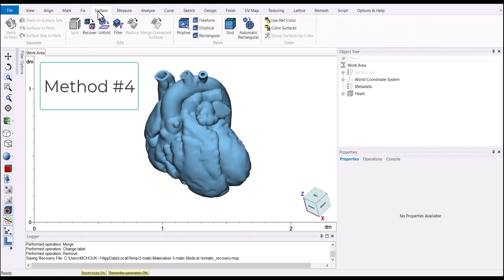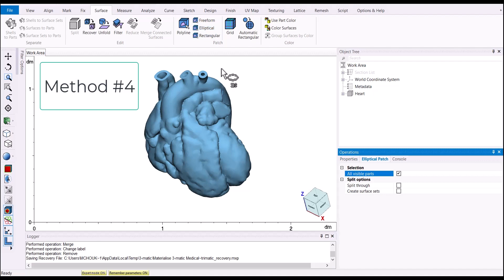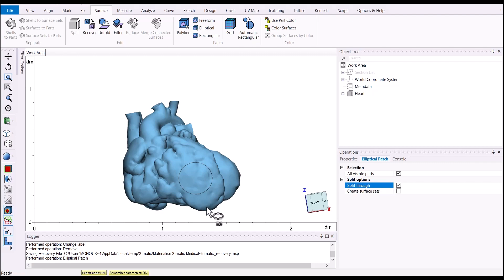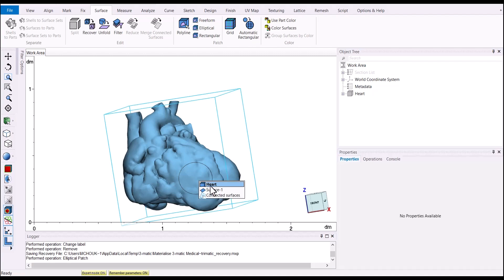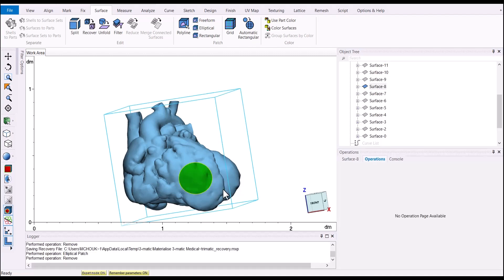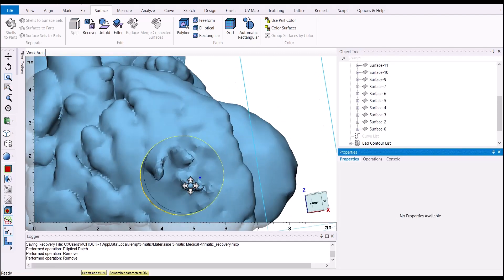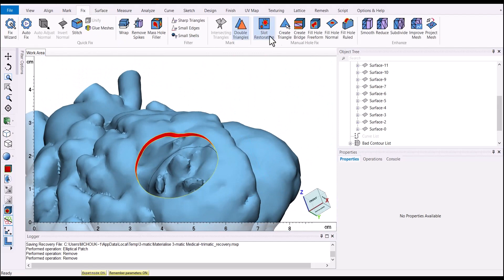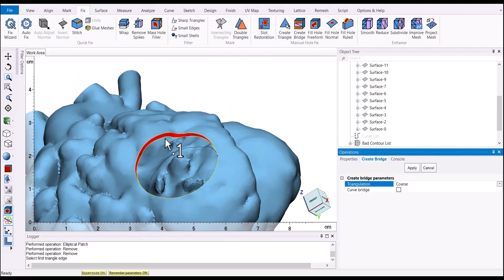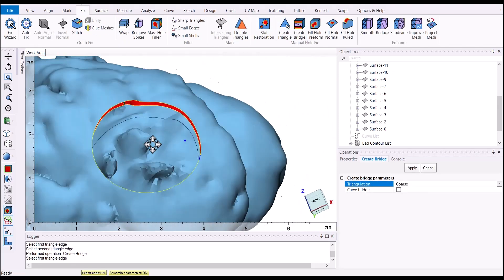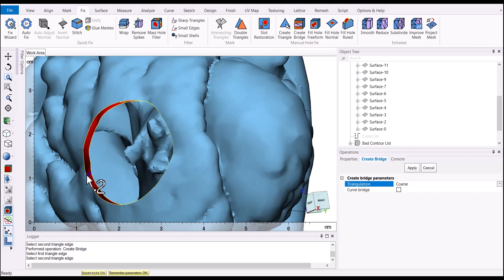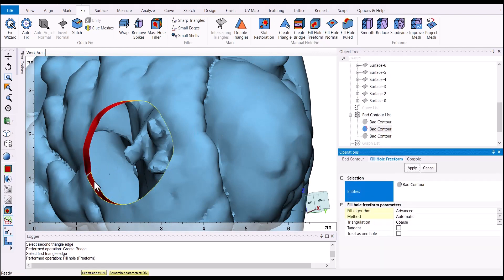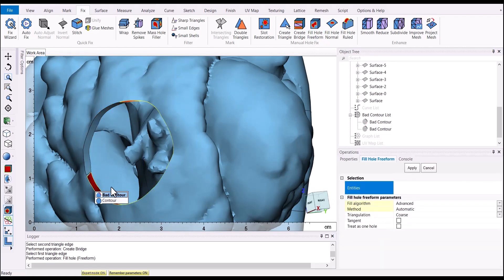Next up, we'll be creating a surface patch, and this is the fastest way to creating those windows and holes. You can draw any kind of shape or create a freeform shape and simply delete that surface to make a window cut. Just make sure you have the tool set to go through the surfaces so you delete both sides of the hollowed model.